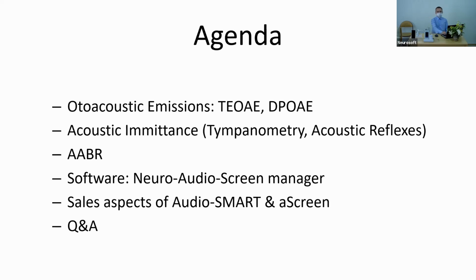So we will start with otoacoustic emissions, theory, applications, and then proceed with live demonstration. Then we will cover acoustic immittance tests, tympanometry, and acoustic reflexes. Then we will proceed with automated ABR, and we'll show again the live demonstration. Today, I'm going to be the patient for all tests.